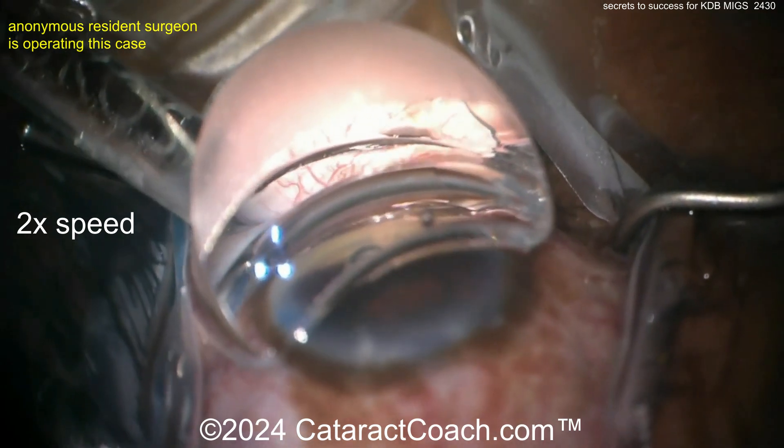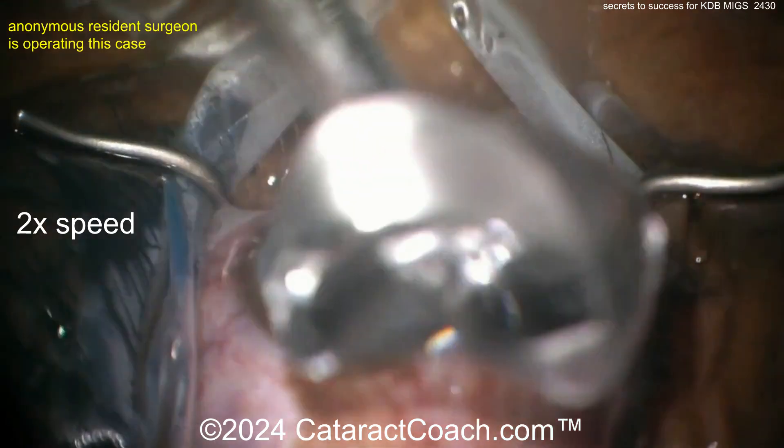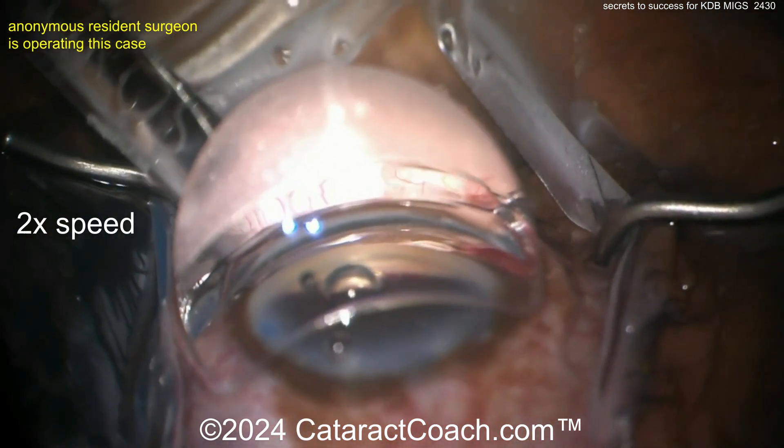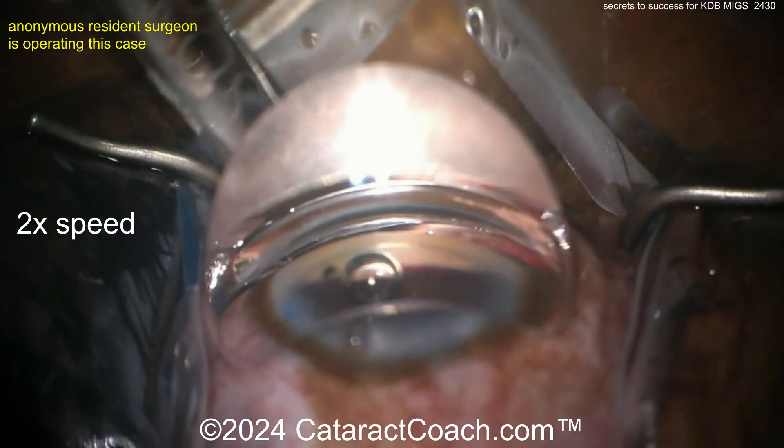Now a little viscoelastic to really open up the canal. Then there's going to be another neat step: stripping away the trabecular meshwork with the IA probe after the procedure is done. There we go — you've opened it up quite nicely.